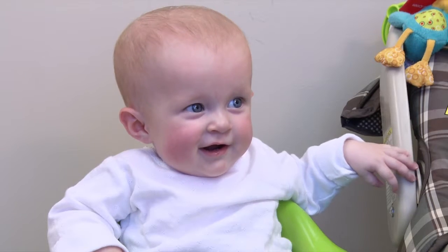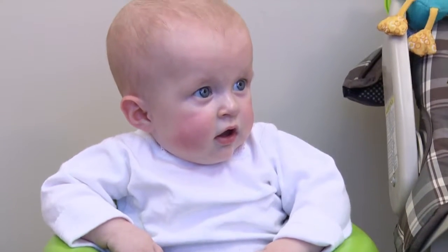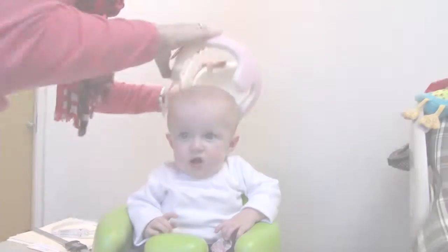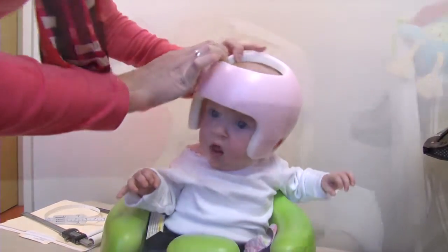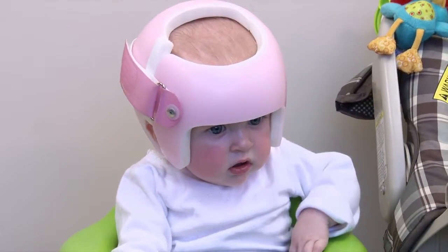You want to stand looking at your child. The bumbo chair is really helpful to keep your baby in place while you're putting the helmet on — it frees up your hands so you have the ability to open it up nice and wide. You start in the back and rotate the helmet over their forehead, and once you get it on you can reposition it so that it sits correctly on their head.